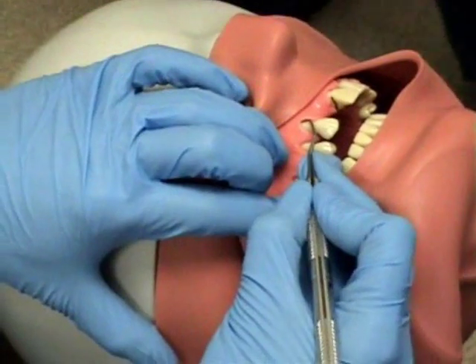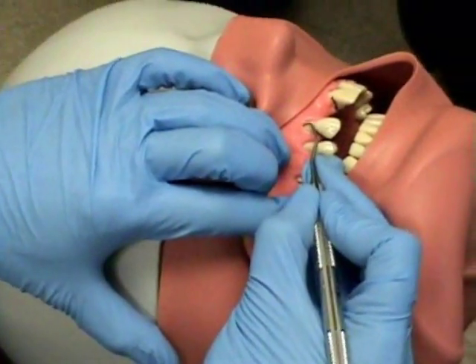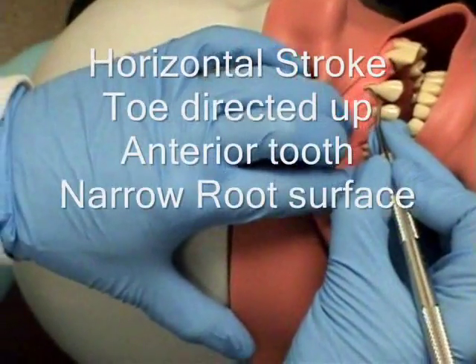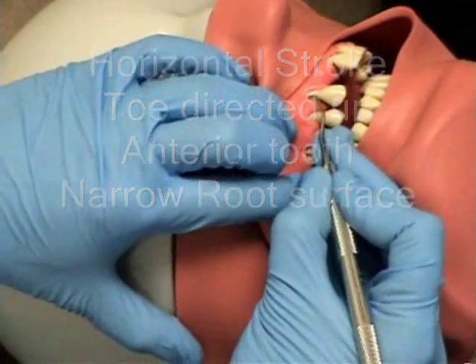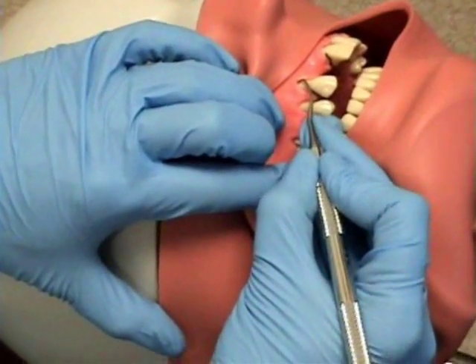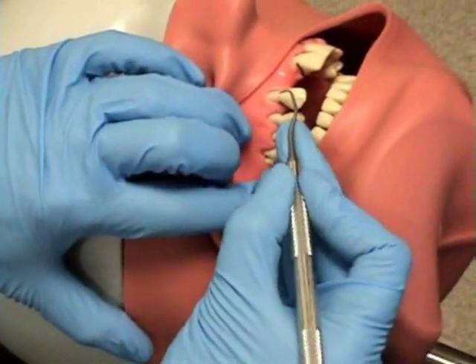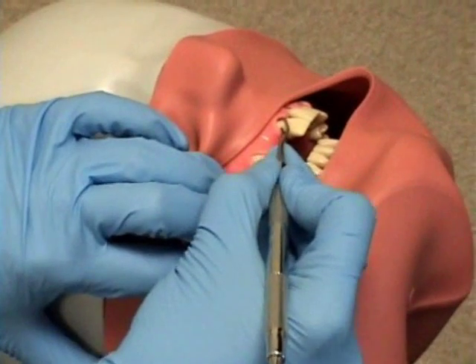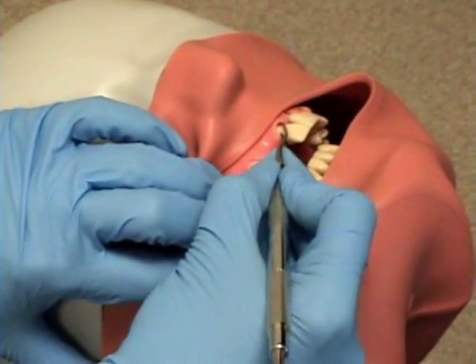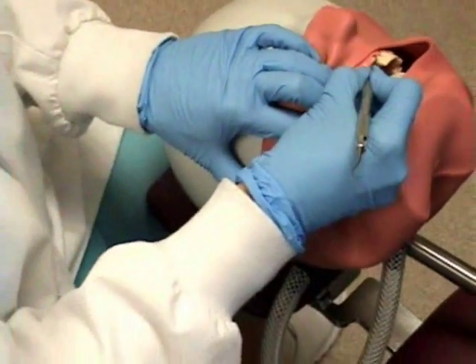An advanced instrumentation technique for the very narrow facial surfaces of the root is to drop the handle of the instrument into the crook of the hand and use a very short, controlled stroke with the toe up horizontally, and the blade is moving horizontally. Ms. Johnson's elbow is tucked into her waist to provide added stability.